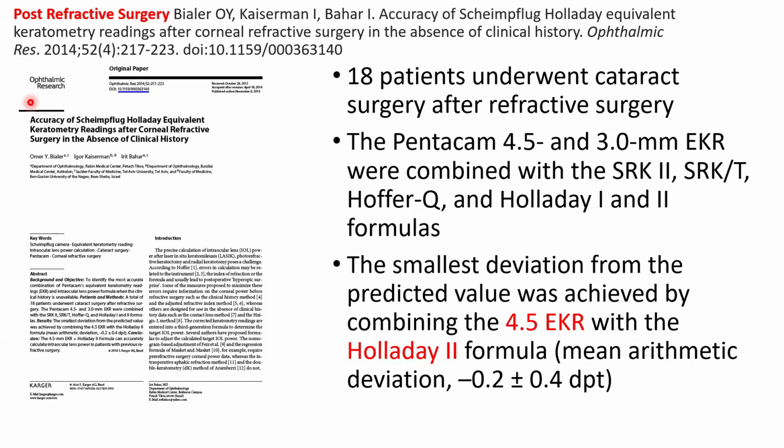Another study was conducted by Omar et al. In this, they compared the accuracy of Scheimpflug Holladay equivalent K readings after corneal refractive surgery in the absence of clinical history. 18 patients underwent cataract surgery after refractive surgery, and the Pentacam 4.5 mm and 3 mm EKR K values were used with the SRK/T, Holladay 1 and 2 formulae.